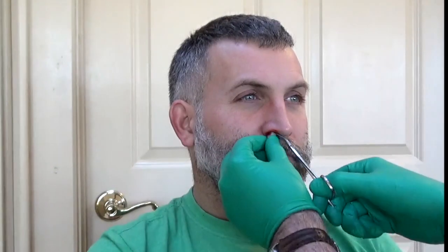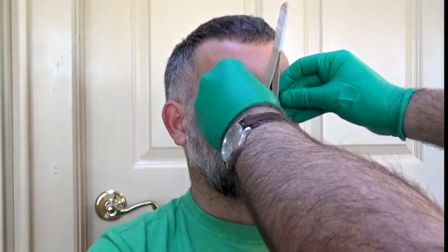Have your patient blow their nose and then put the hemostatic agent up their affected nostril, follow it up with the sponge sticks on each side for a little bit more pressure, and then put on the nasal tongs. You can see why I call this the woodpecker walrus technique.